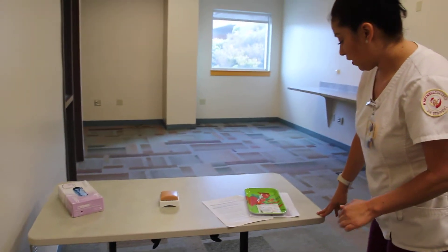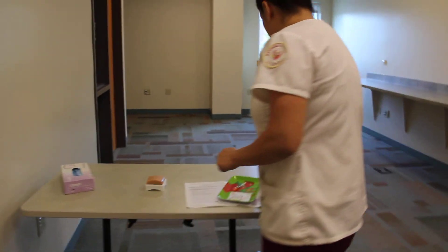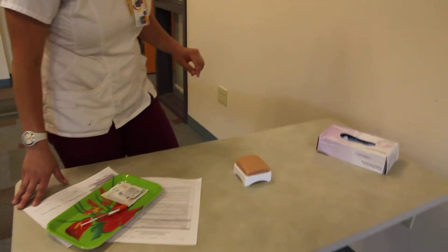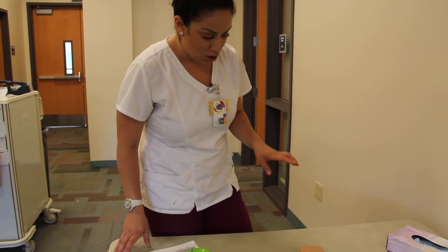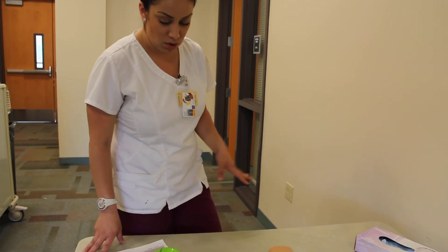Hello, Mrs. Smith. My name is Priscilla and I'm going to be giving you your insulin injection. Can I just verify your armband? Mary Smith, and your date of birth is 2/2/85. I'm just going to double check and verify with you — do you have any allergies I need to be aware of? No allergies? Great.